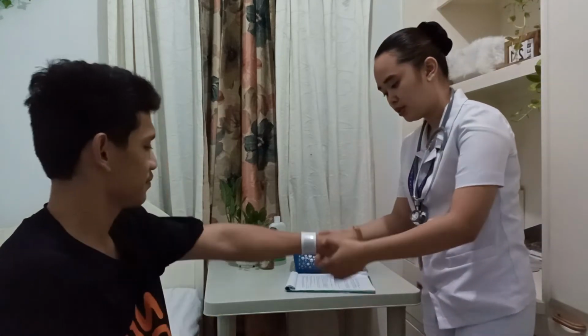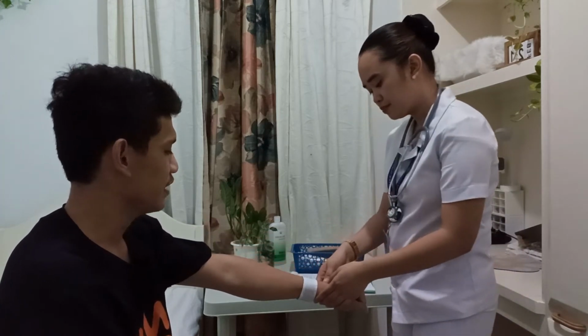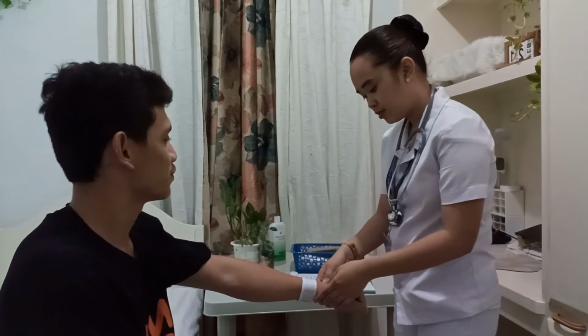Good day, sir. I am your student nurse for today. Can I see your wristband, please? Can you state your name? I am Patrick Anay. Your birthday? It's on April 26, 2002. Okay, and how would you like me to call you? Just call me Mr. Patrick. Okay, Mr. Patrick, today I'm going to be assessing your blood pressure, and I just need you to feel at ease and just relax. Would that be alright?